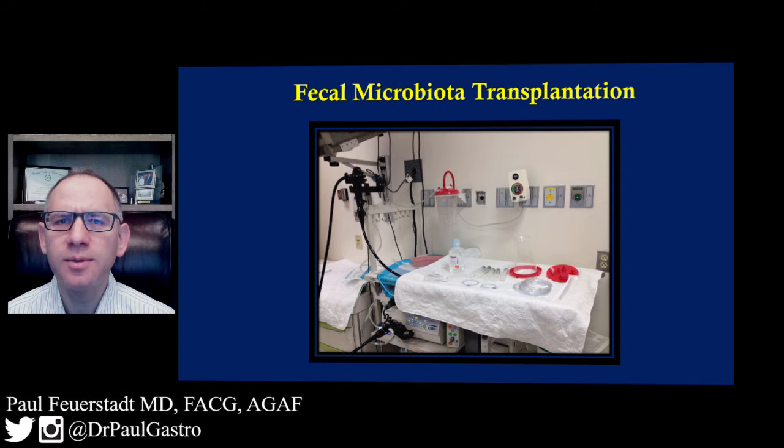When they present to the endoscopy suite, they are given a couple of Dulcolax to help them have a bowel movement. Once they have a bowel movement, the specimen is stored typically at room temperature and then brought into the endoscopy suite room. At that point, 100 grams of the specimen is mixed in a blender with about 500 milliliters of normal saline. It is blenderized for about 5 minutes and then sieved through a polyp retrieval kit. We are sieving off the fibrous matter that is present within the stool.